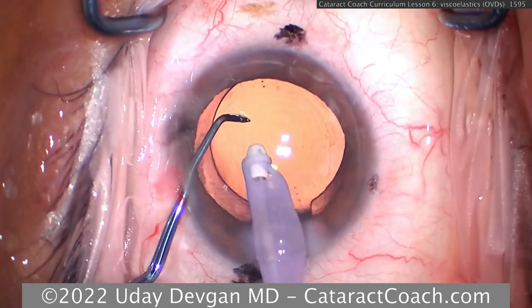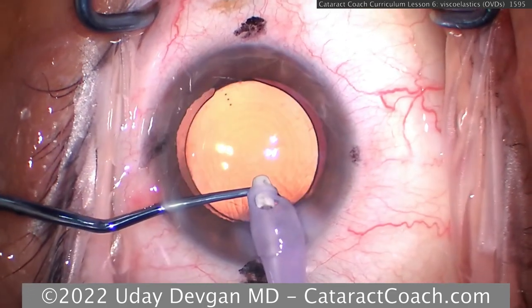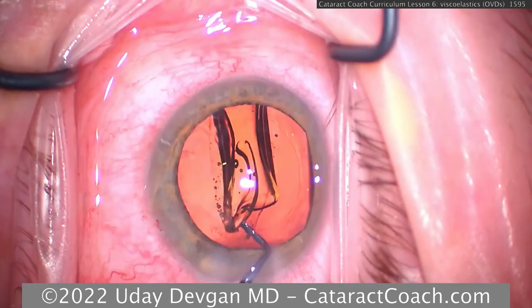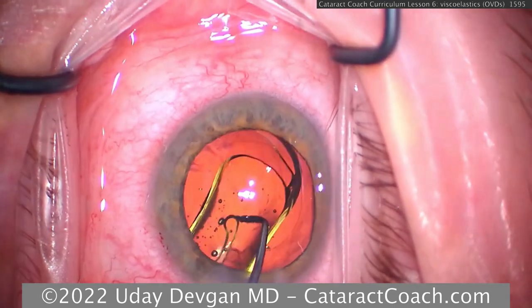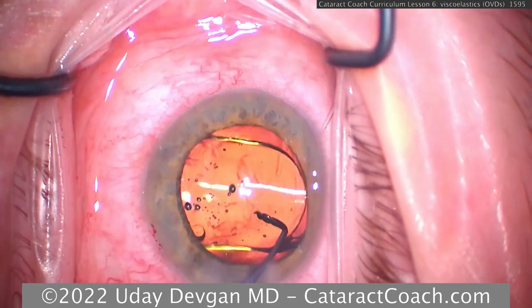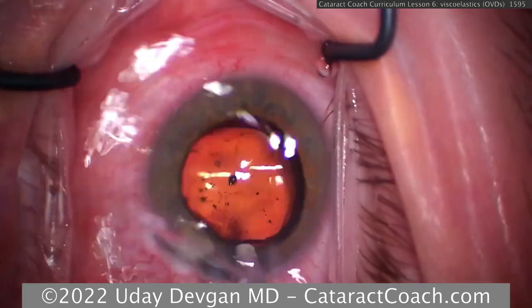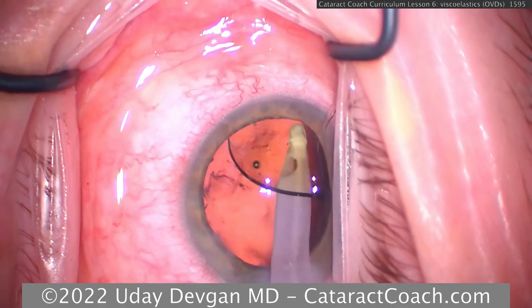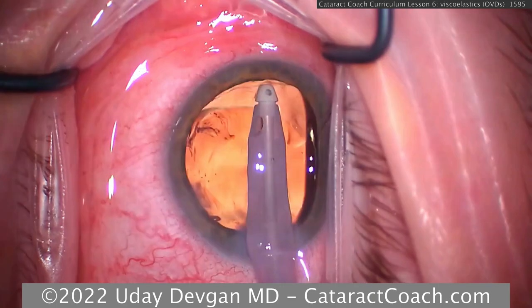And this maneuver does take some practice. You're shifting the IOL within the capsular bag. And remember, you're lifting the IOL up towards the corneal apex. Let's show you one more video of going behind the IOL. So here's the IOL going in the capsular bag as it unfolds quite nicely. We'll rotate it around. It helps to keep the haptics like this, 90 degrees away from your incision. That allows you to place your phaco probe in the subincisional area, get under the IOL optic, lift it towards the corneal apex, and then remove viscoelastic.